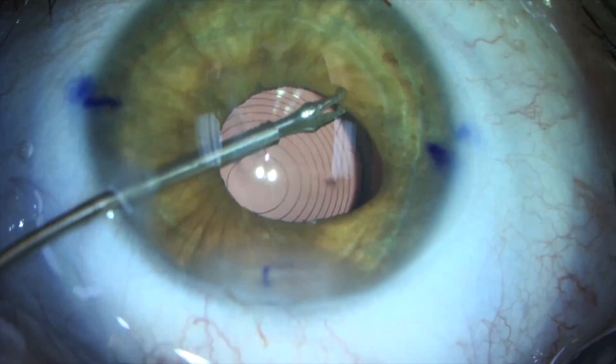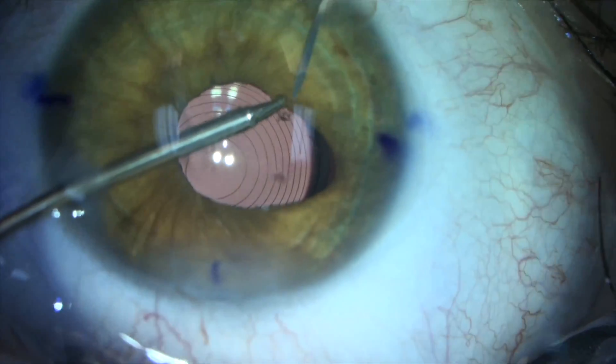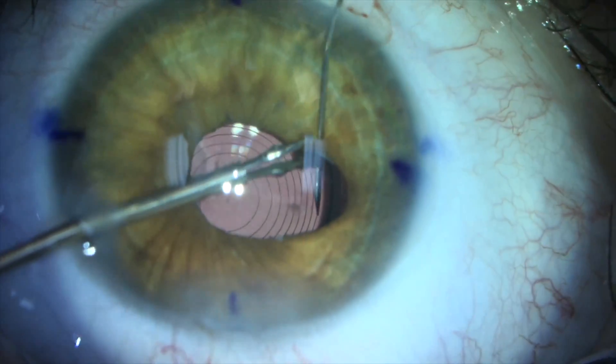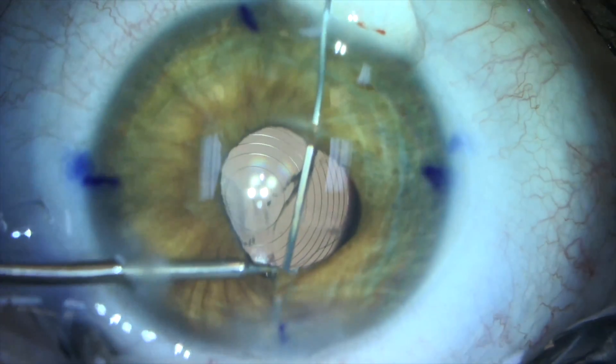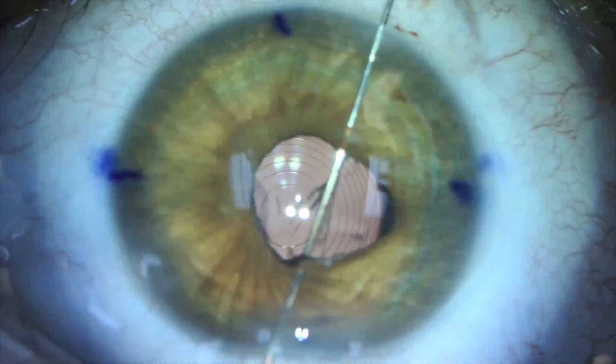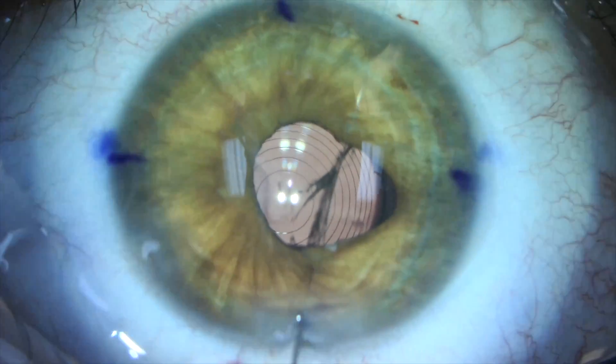Micro forceps stabilize the iris in the area of the torn iris sphincter. The suture needle is passed as close to the edge of the iris as possible. Too close to the edge and the iris may tear as the needle is passed. Passing the needle too far from the pupil edge will not create an optimal cosmetic result.